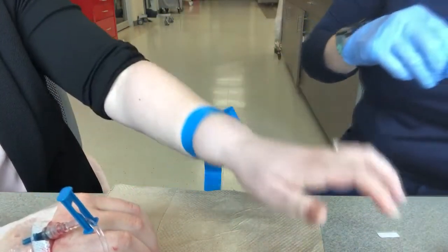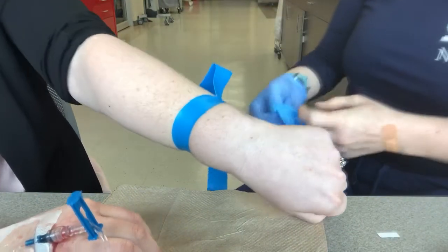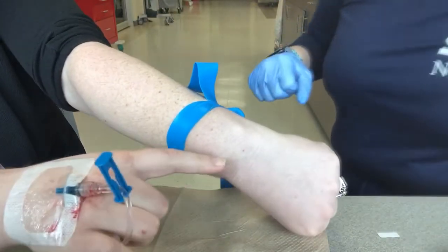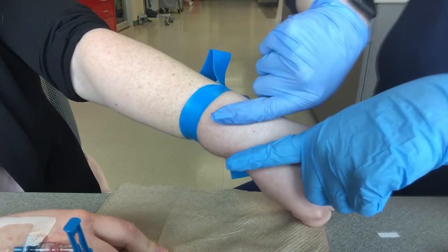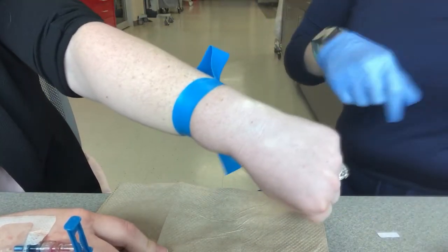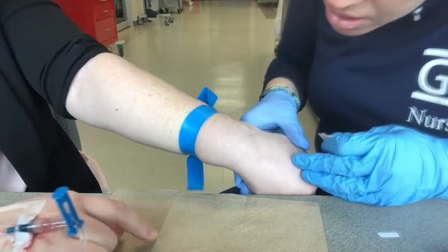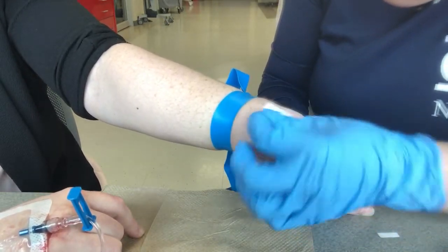You have to be able to feel your fingers. So if that happens, go find yourself a glove that actually fits. Okay, it's right like that — don't move.